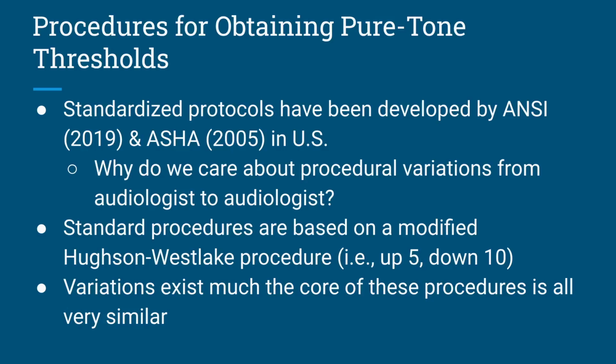Why is it more popular? Because with the ASHA protocol, you can access it fairly easily. I'm not even sure if you need a membership to ASHA to access it. Even if you do, many audiologists have memberships to ASHA. To get the ANSI protocol, you have to be a member of the Acoustical Society of America if you want a free copy of it, and not that many audiologists are members of the Acoustical Society of America.